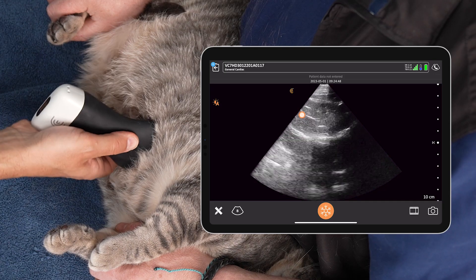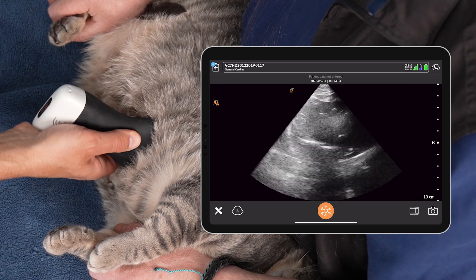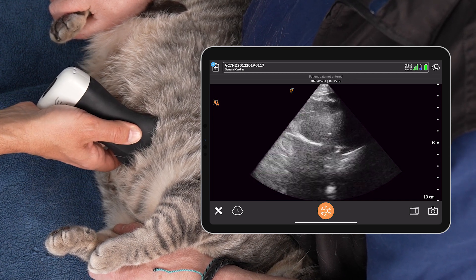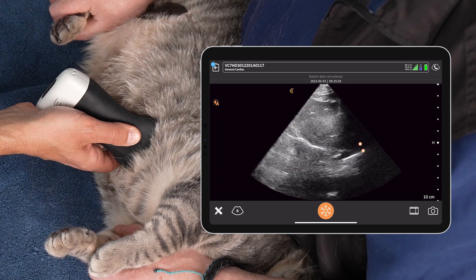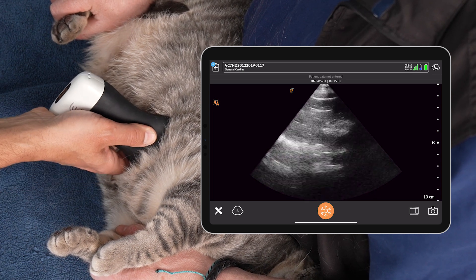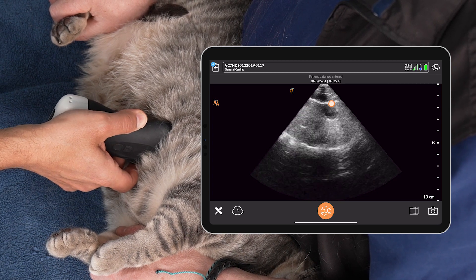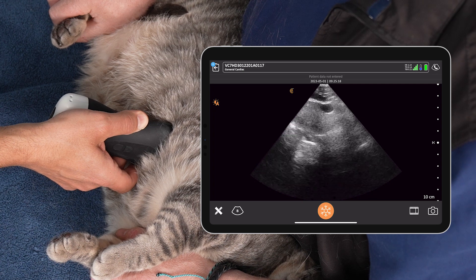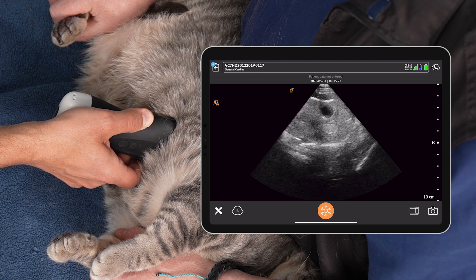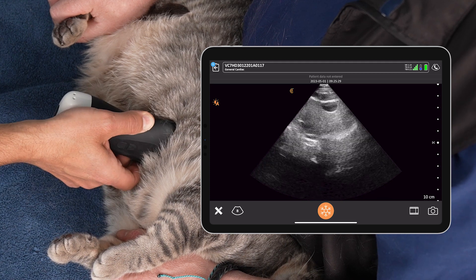So we're going to get the image in short axis — we can see the liver nicely visible. Any fluid? No fluid there. I'm going to fan the probe so that the liver disappears. What about the caudal vena cava? You can actually see it nicely here — we can see the change in diameter, nice cardiac pulsation there. Gallbladder — can you show me the gallbladder in short axis? Let me try to find it again. There it is right there: nice thin-walled gallbladder. Can you see the heart beyond the diaphragm in short axis? I sure can — there it is right there. Sometimes it is easier to see in short axis than long, so we do encourage both views.